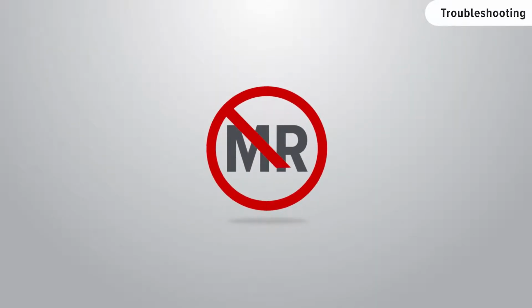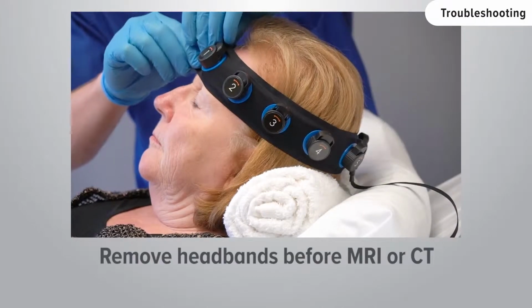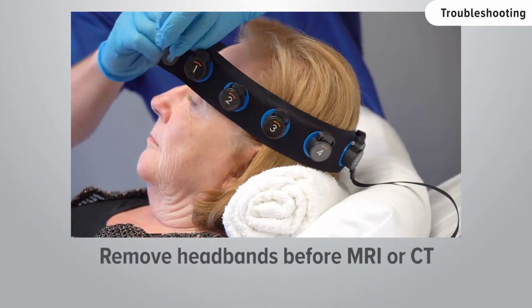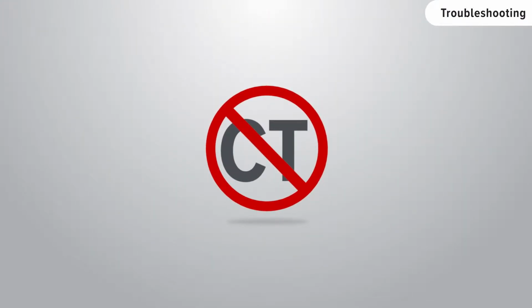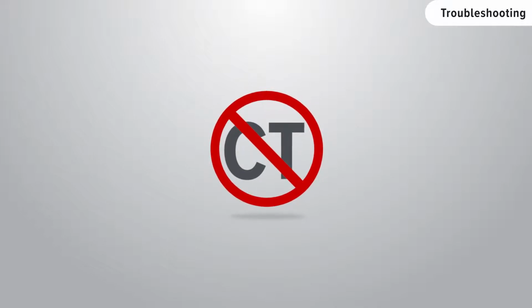The headband and recorder are not MRI compatible. It is important to remove the headband and recorder from the patient before entering the MRI room. It is also best to remove the headband and recorder from the patient during CT imaging, since they are radio-opaque and could interfere with the area being imaged.